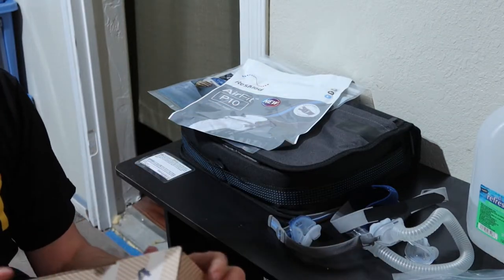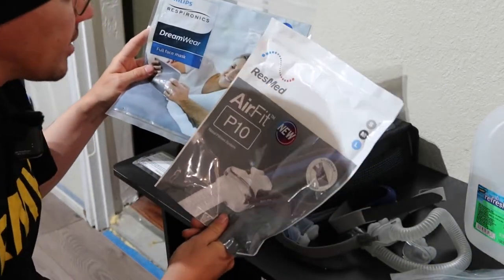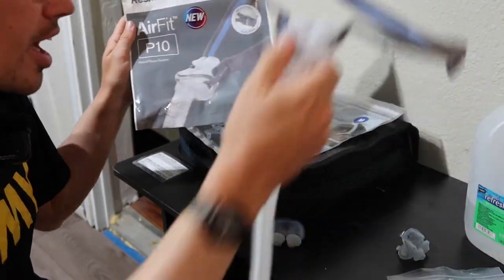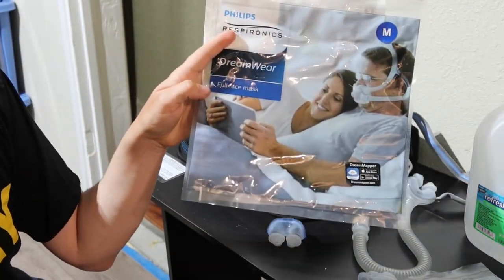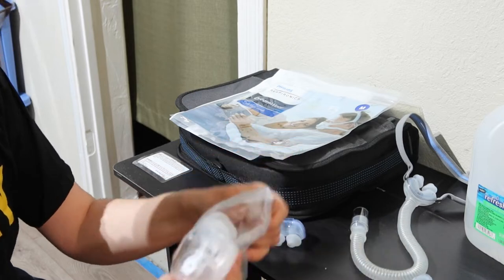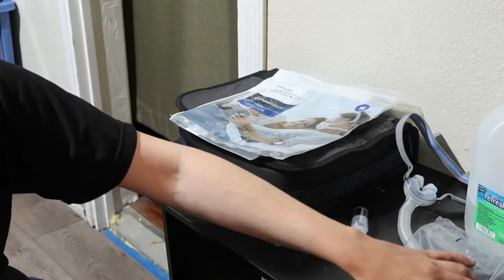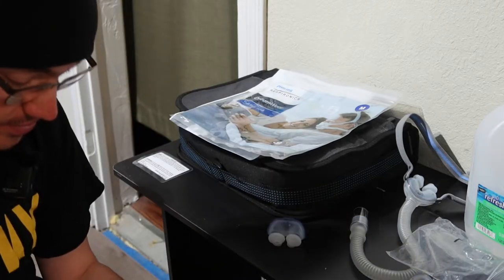This right here is a CPAP. You get two masks nowadays. One is called the AirFit P10, which gets inserted into your nose. The other is the Dreamwear, which you put on your face. We're going to show you the pros, the cons, how to use it, etc.